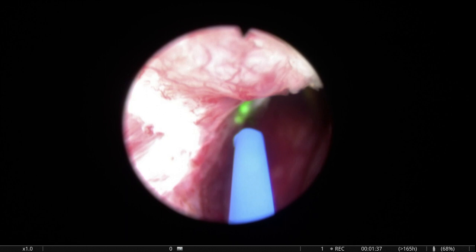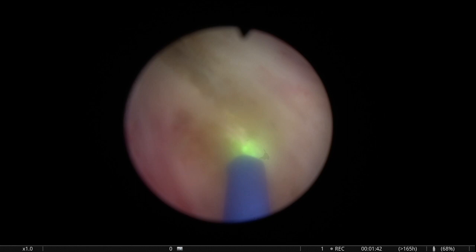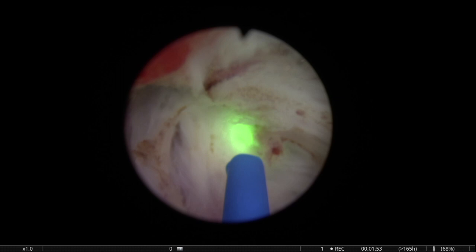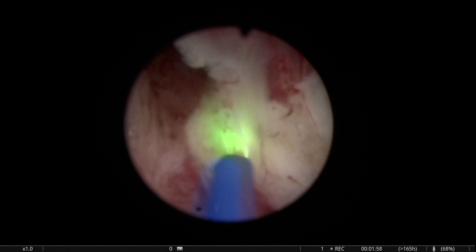Here we are using a low power laser. The settings are 2.2 joules of energy and 18 hertz. And I think that's more or less 40 watts. Well, I should check it out. I think it's about 40 watts.